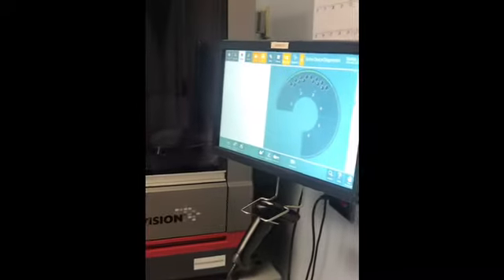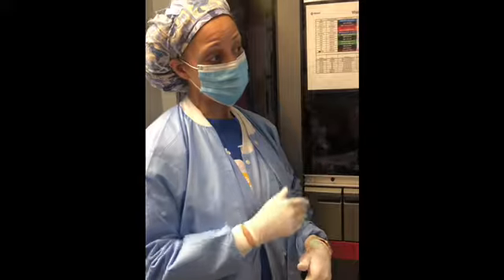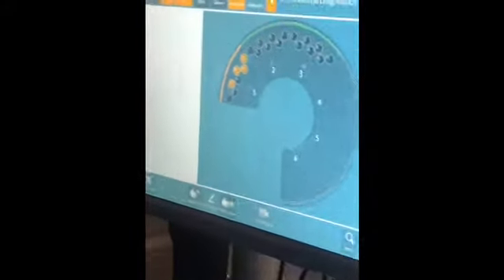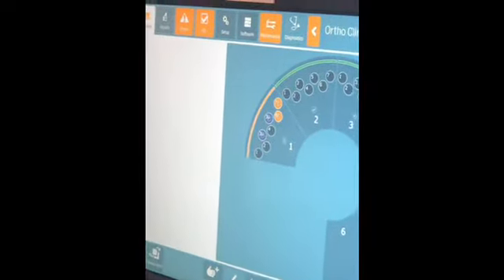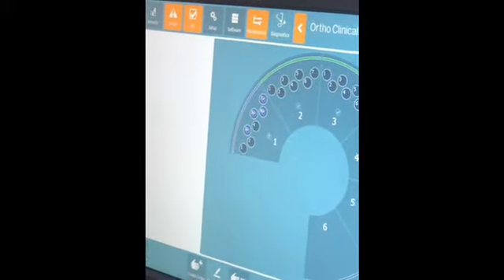And the instrument will recognize the barcode and the container ID number. And that barcode is associated with that container ID number. So whatever test has been ordered on that, the Vision is gonna automatically pick it up and go ahead and start running. As you can see, it picked up. And it picked those two up, okay?